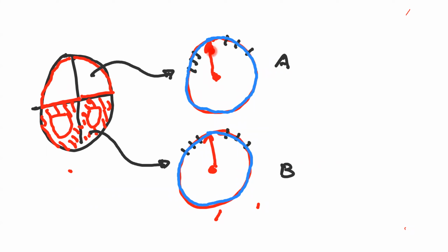While atrial depolarization, the force is less and the speed also less. So the needle fluctuation will be as this way. This kind of needle fluctuation. මේක ඕන වෙනවා. This is very important. Right? This kind of needle fluctuation, right? 0. Go here and the depolarization happens. Then after saturated, there is no magnet force, then needle will come to 0 point. Right? So come to the B.